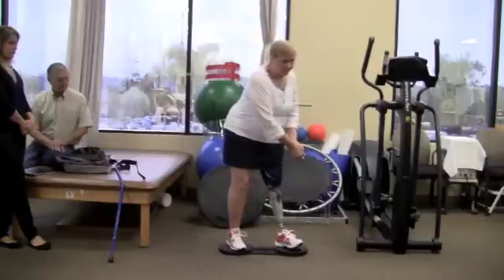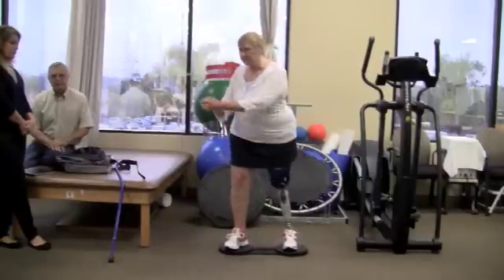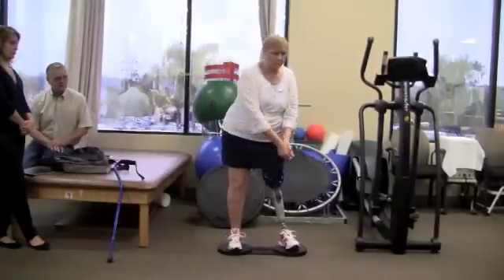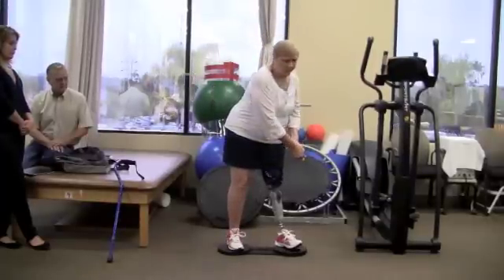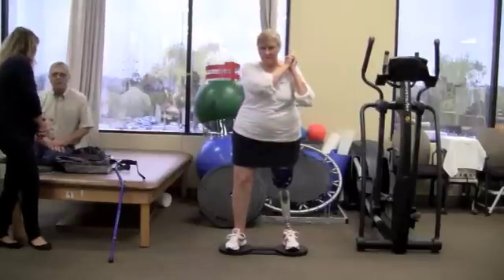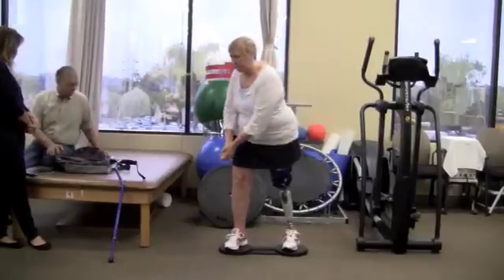One day he suggested I go to the other office where he had this board he wanted me to try. I took his suggestion and went to the other office for a few sessions. There he introduced me to this 8-board. After just two times of using it, I noticed a huge improvement.